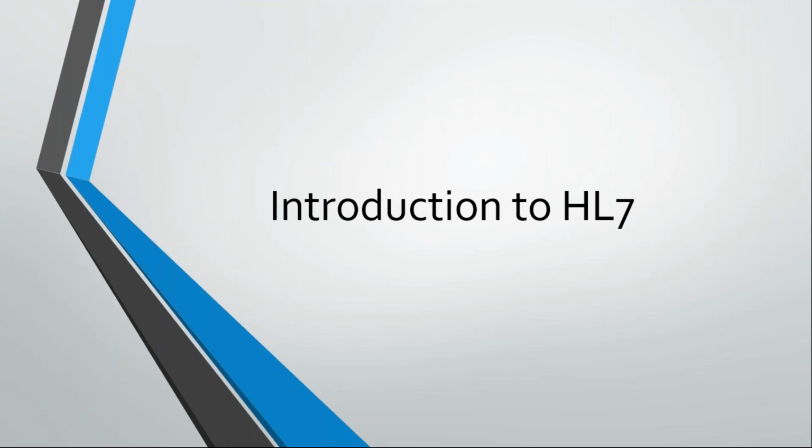In today's session, we are going to take a look at the introduction of HL7. This training is all about learning HL7 and also learning Mirth Connect. Our entire training is divided into two sections. First would be everything functional about HL7, where we'll be taking a look at what is HL7, how the HL7 name came up, and what the different message types, different segments and all are.